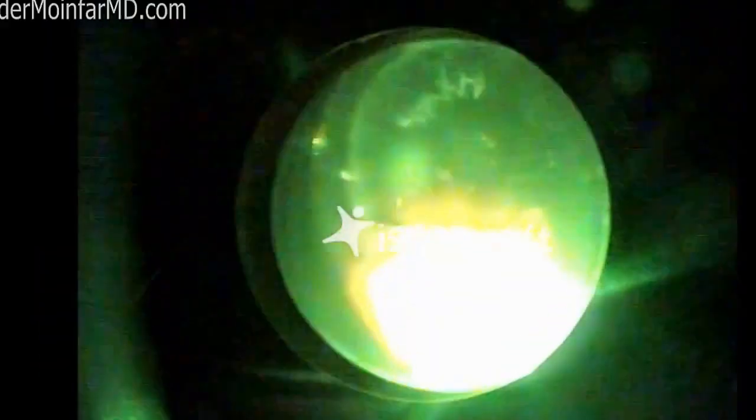But what I'm doing here now, with every flash that you see here, the green light, is actually applying a spot of laser. And again, there's another foot pedal connected to the machine. So the surgeon basically has 3 foot pedals on the floor. One of them is to control the microscope, the other one is to control the vitrectomy machine, and the third is to control the laser. And in some places there may be a 4th pedal that controls the lens. It's called an inverter, and basically with the type of wide field lens that we have, you need to invert it, otherwise we get an upside down and left-right reversed image. So there's always 3 and sometimes 4 foot pedals, and of course both hands are working at the same time.